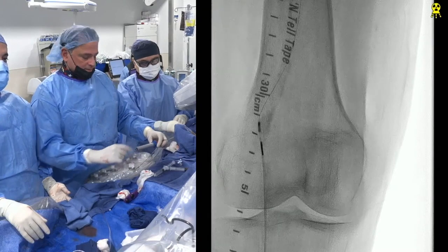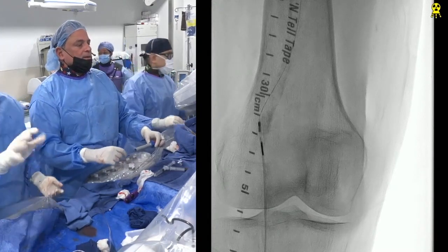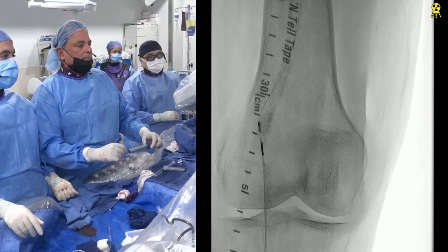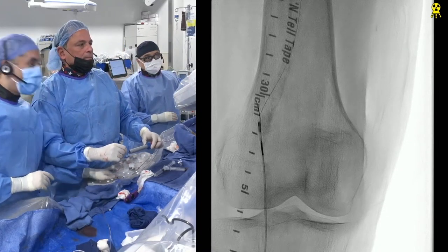All right, let's see here. All right, Ray, why don't you prep the antegrade here? Oh, you can turn the chromoflow off. That's fine. Because we balloon down here too, right? Correct. With a 3-0. Just a 3-0, right? If you use like a 4-0 or something, then yes, I think it will pass through.